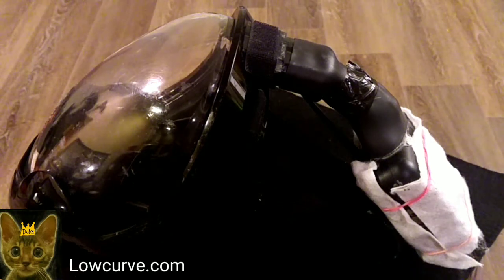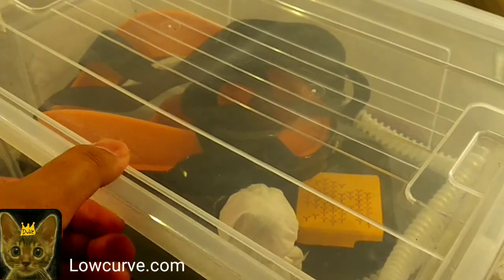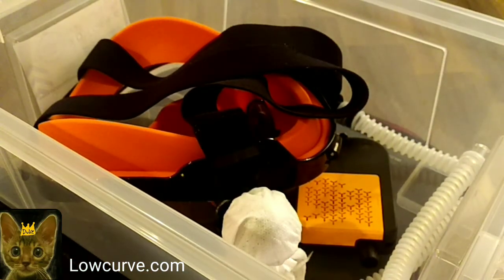Hello and welcome to the long-awaited and long-delayed tutorial-ish of Infinite N95 version 4. Now, I want to preface this with the idea that anything beyond the original Infinite N95 is mostly conceptual, and it's meant to be open source, so these methods can be accomplished in multiple different iterations and configurations and different styles.